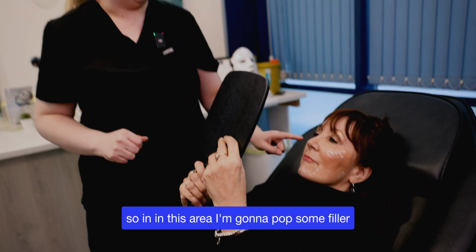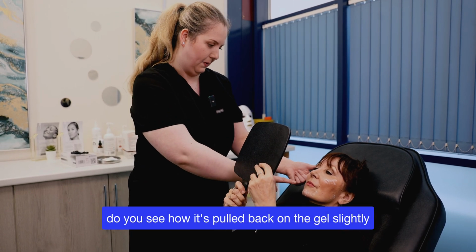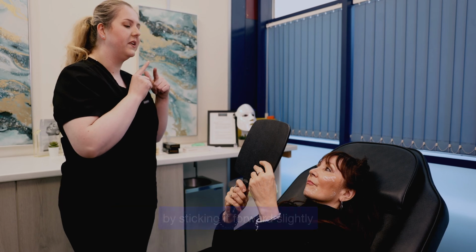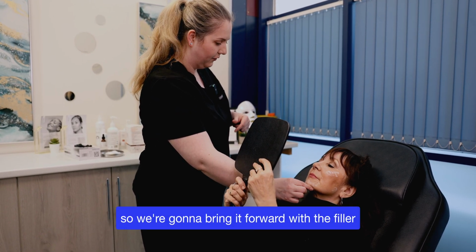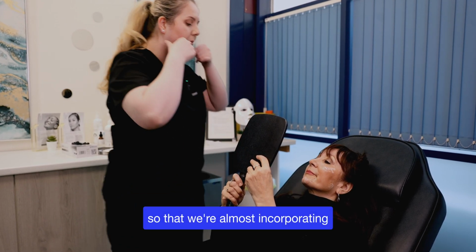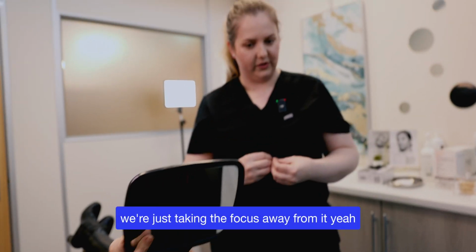So in this area, I'm going to pop some filler, and that's going to have this effect. Do you see how it's pulled back on the jowl slightly? Yeah. And just what you did there with your jaw by sticking it forward slightly, that's exactly what we're going to do with the chin. So we're going to bring it forward with the filler, then we're going to fill some in here so that we're almost incorporating the jowl into your jawline. So we're not getting rid of it, we're just taking the focus away from it.